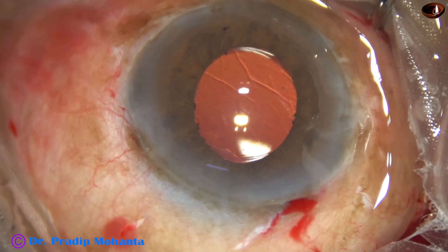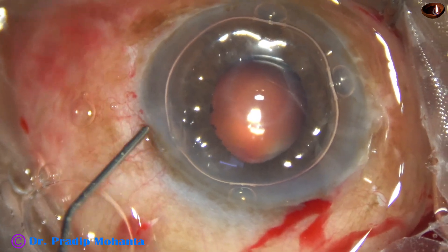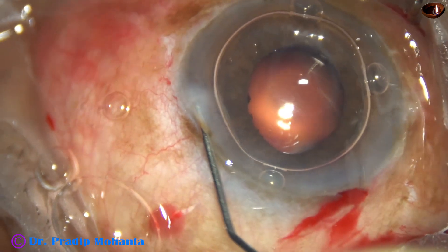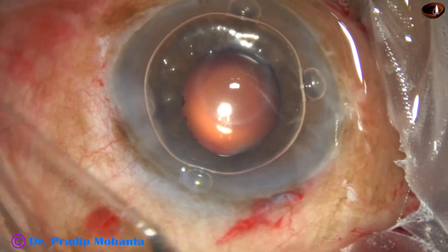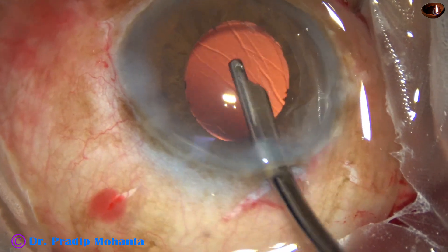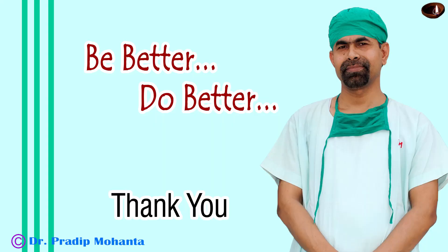I am thinking about how to improve followability of the pieces to the tip. Maybe I need to use higher vacuum — 450 is not ideal. As I increase the vacuum to about 470, I have to monitor anterior chamber stability. Next time I will call Mr. Mani of Appasamy Associates and ask about higher vacuum settings and how to increase followability and hold the pieces nicely. The case is concluded. Thank you very much for your attention. I hope this video will encourage you to try Appasamy's Galaxy Pro Orbit FACO machine.